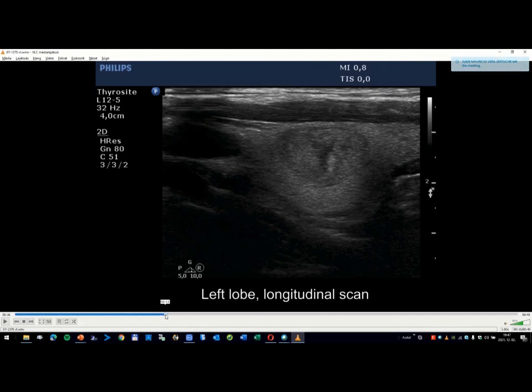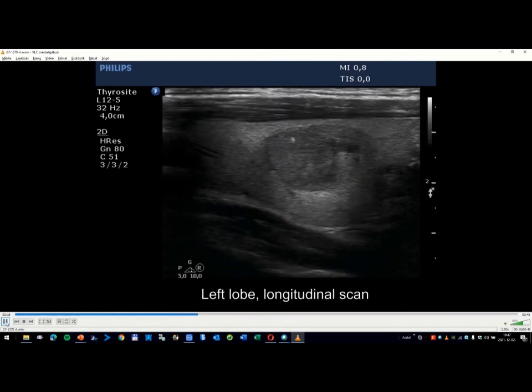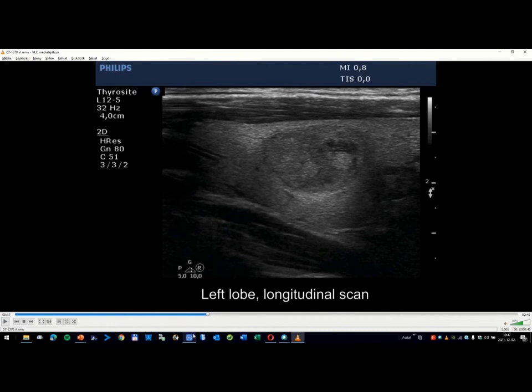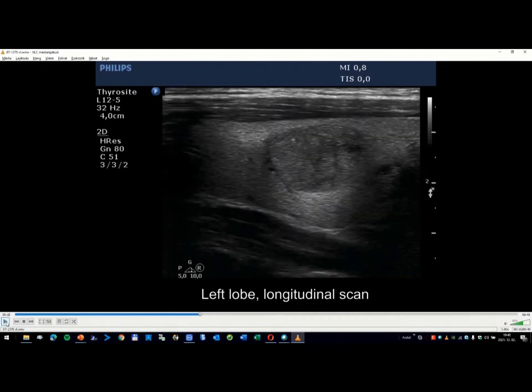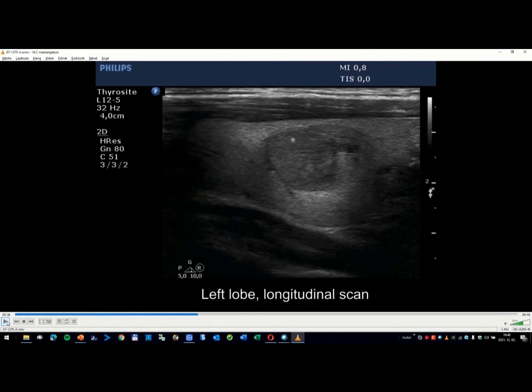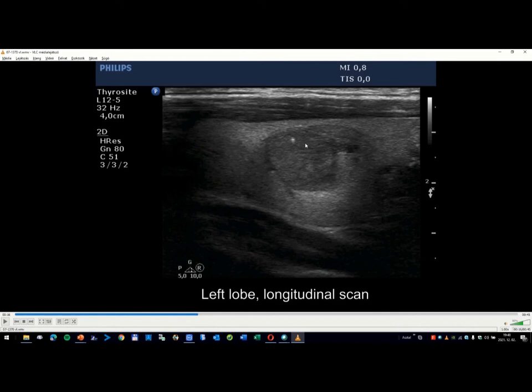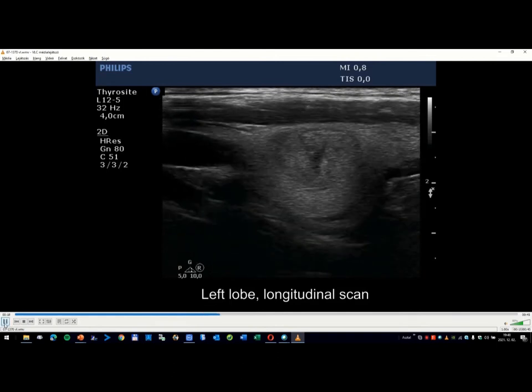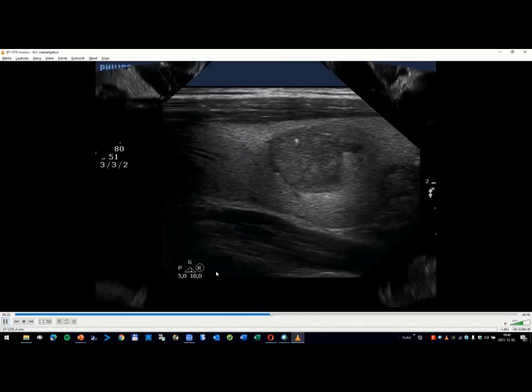I don't think that we could think this nodule would be problematic. I raise your attention to this single hyperechoic spot. This was the only one. Maybe this is a comet tail artifact because it has some tail, but it could be other reasons, technical artifacts. But in such a large nodule, a single, if it would be a microcalcification, should not cause great concern. In such a lesion with such a diameter, a single microcalcification might have an absolutely other meaning.